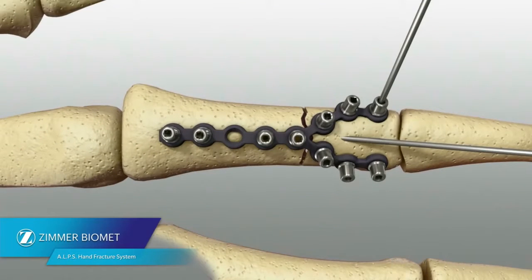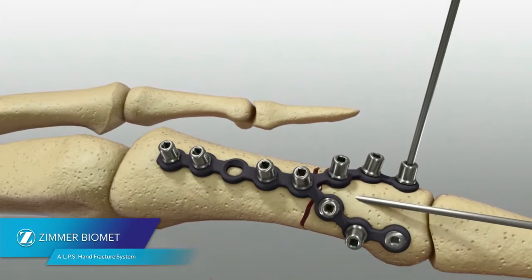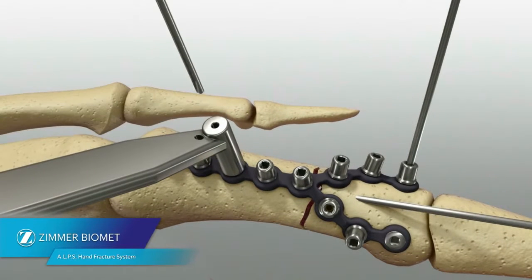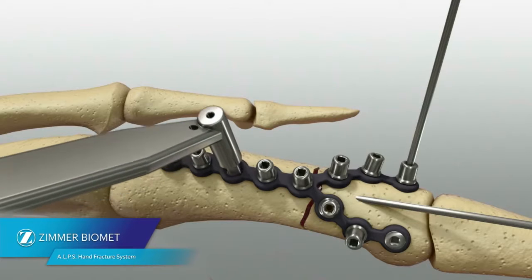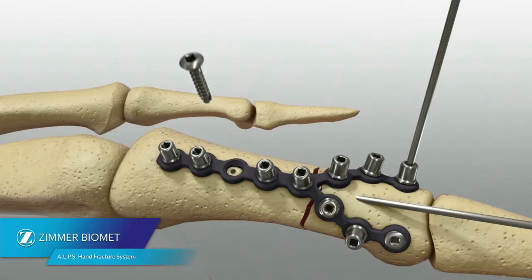Remove the fast guide using the driver and select a locking, non-locking or multi-directional locking screw based on the plate hole and type of fracture. When desired, a 1.5 mm non-locking screw or 2.5 mm locking screw paired with a washer can be placed through a compression hole to achieve compression at the fracture site. Use the same driver to insert the screw into the plate.